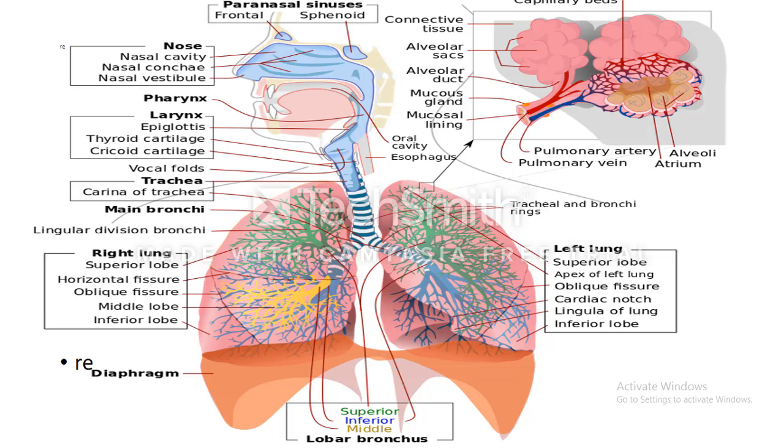And in this cavity, this papilla of bone form concha, inferior and superior. By this concha formed three parts in nasal cavity. One, vestibule. Two, respiratory zone. And three, olfactory zone.